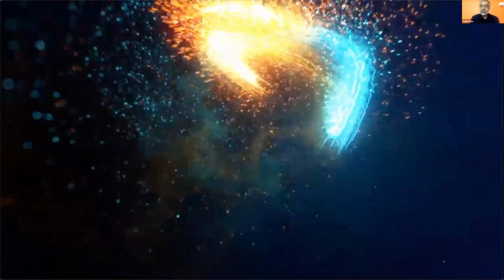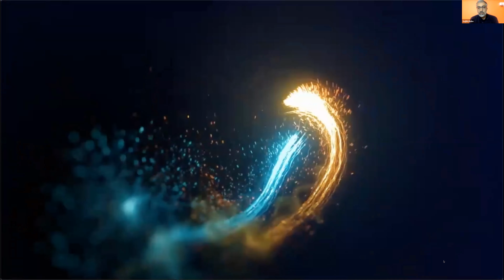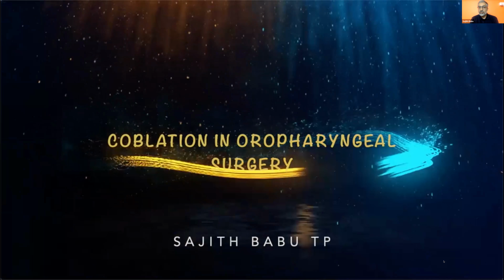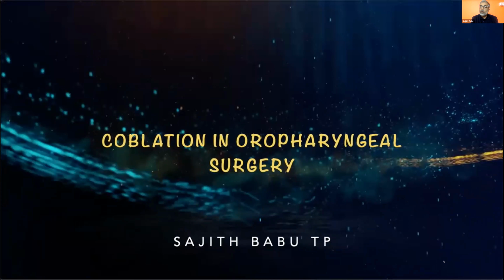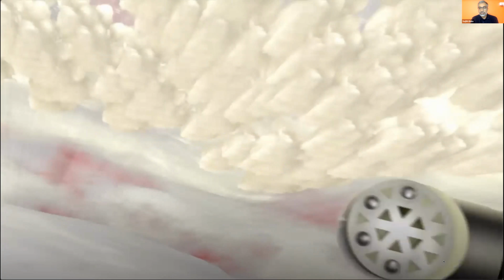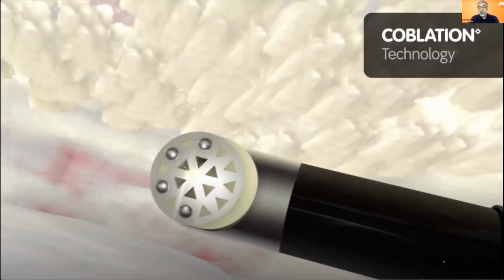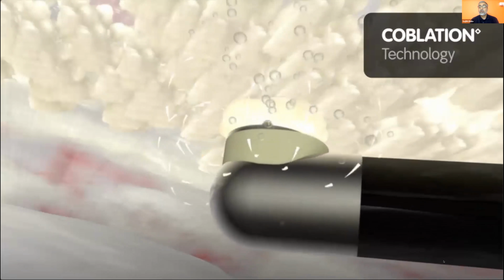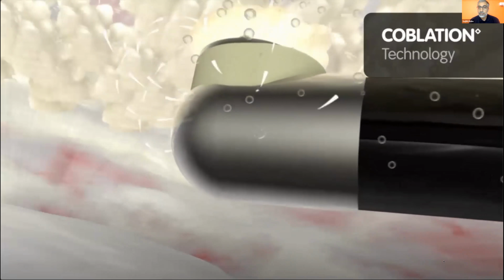Surgery has changed with the introduction of robotics. Here we are talking about technologies, and another technology that has come in the way is coblation, which is used in oropharyngeal surgery. This technology uses plasma, wherein the tissue interface produces a plasma.